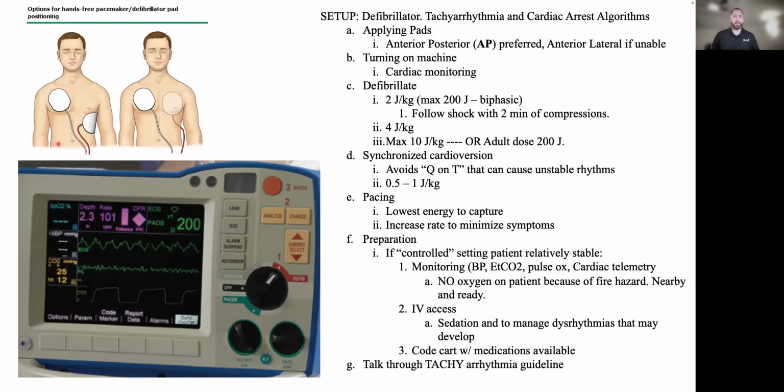So you're going to apply the pads typically across the heart. So this is on the patient's right side and left lateral side. So you can cross the heart or from anterior and posterior. So you'll turn that machine on. You'll turn this first lever, look for the numbers. Most of your machines will look similar to this.